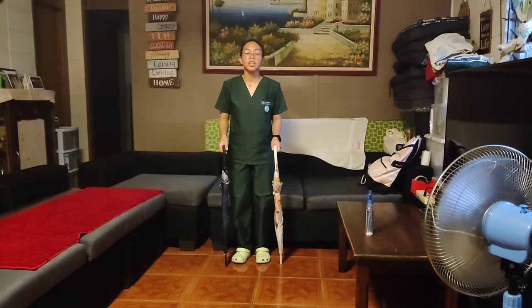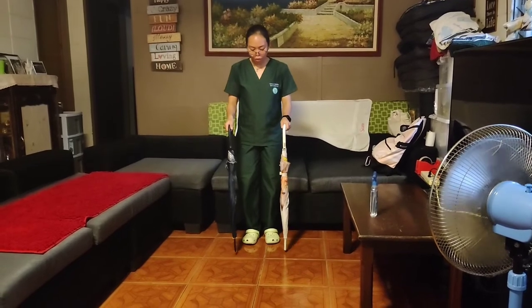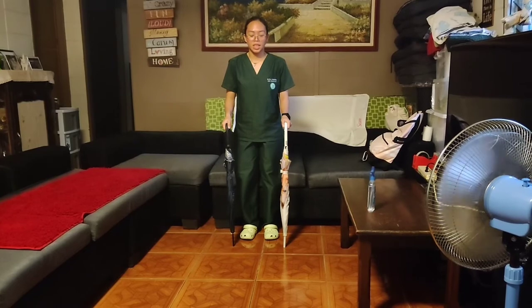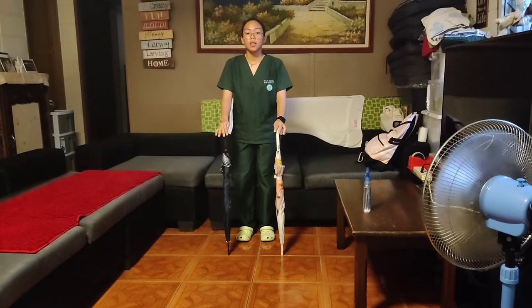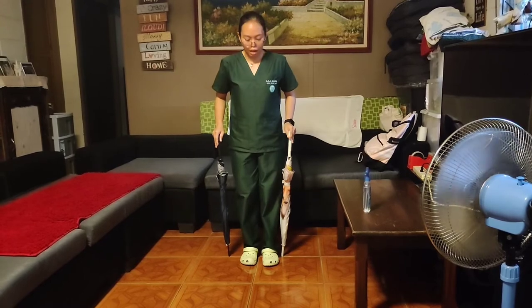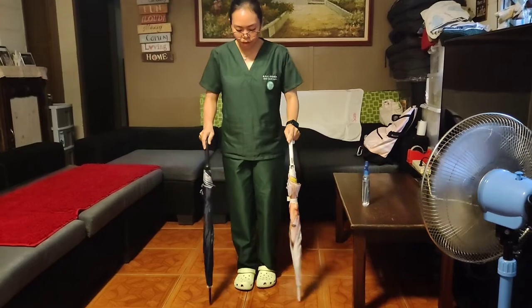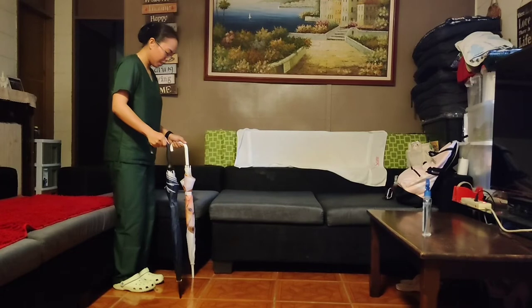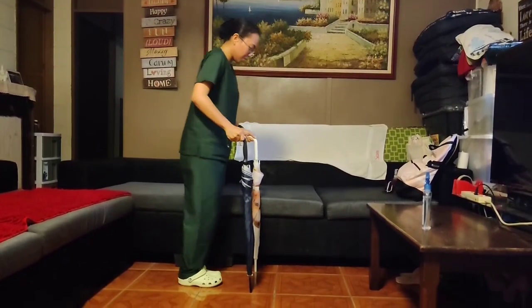Next, instruct the patient using the swing-to gait. Begin in the tripod position. Advance both crutches forward, then let the crutches hold the body weight and proceed by swinging both legs to the crutches. Repeat: advance both crutches, then swing both legs forward.